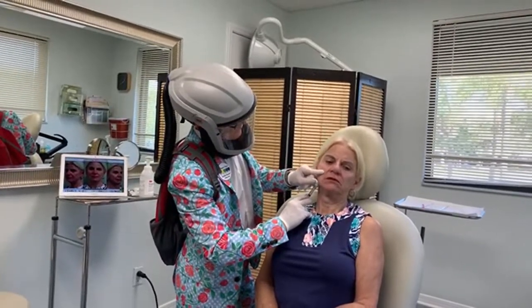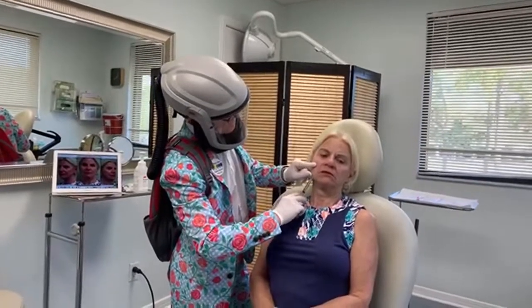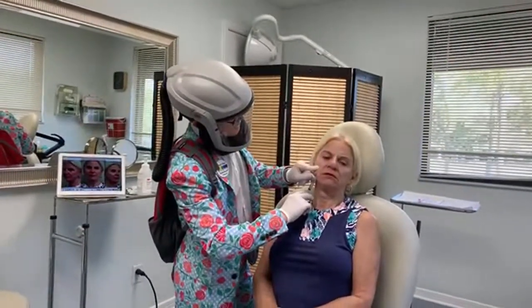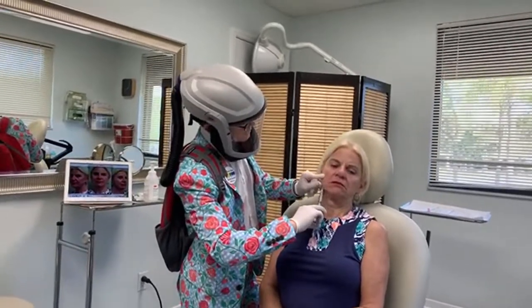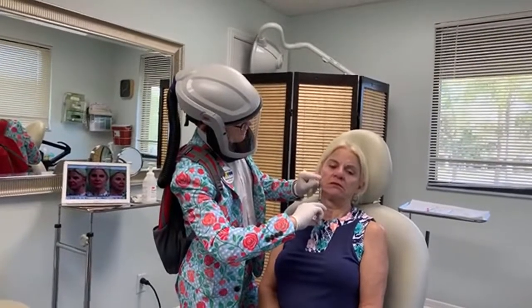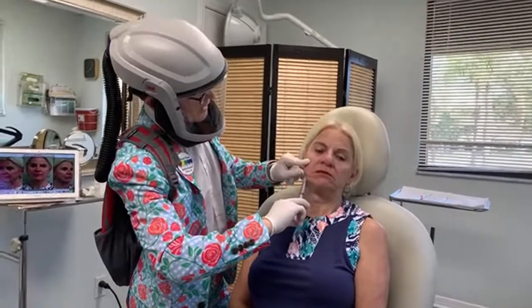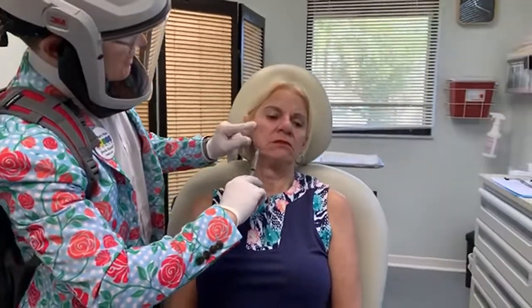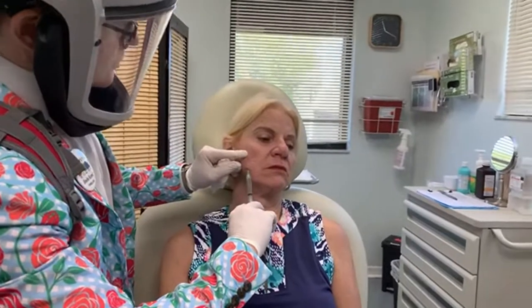A little tender. So I like to use some of the subcutaneous lidocaine injection because it does make it much more comfortable, and then you can concentrate on the injection. The patient does need to be comfortable. It's hard to get as good of a result if you're not keeping the patient comfortable. I do have laughing gas too, but most patients don't want that, and I can use Valium, but if you use Valium, then you need a driver. Right. So again, most patients don't want to do that.